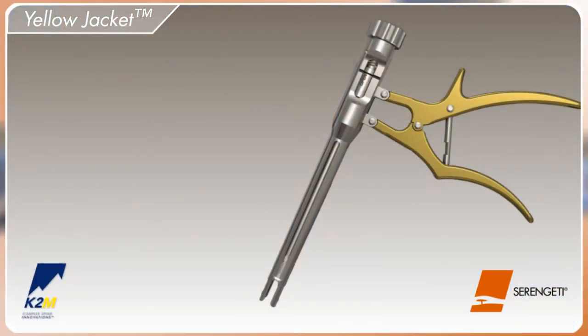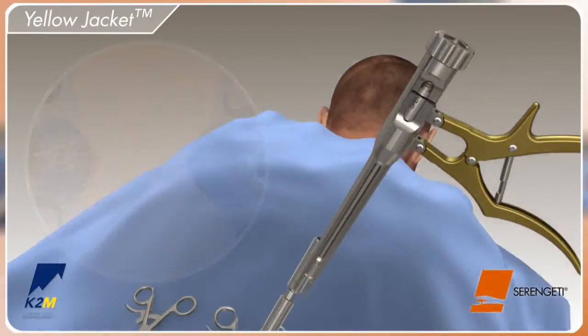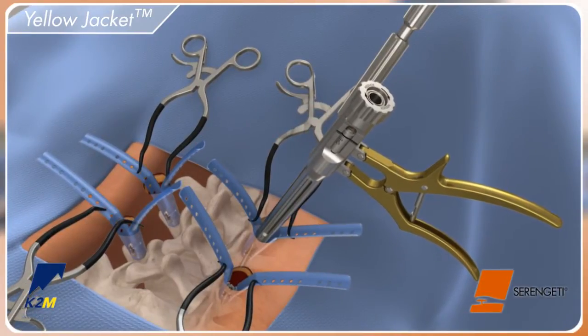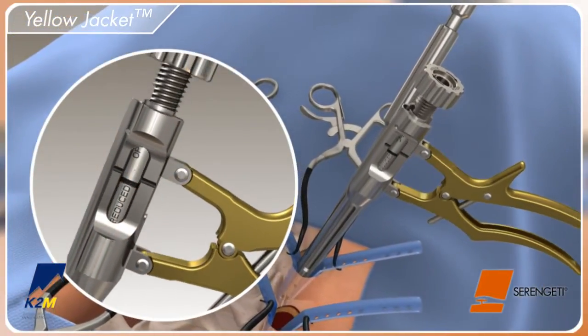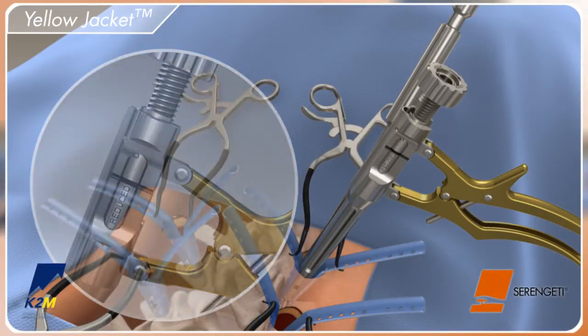If reduction is necessary, utilize the visualization provided by the retractors to determine the orientation of the screw head. Position the yellow jacket down the Serengeti retractor and apply a downward force directly over the screw head to attach the instrument. Pull axially on the instrument to confirm attachment. For fast action reduction, push the locking bar forward and squeeze the handles together. The line on the measurement window will confirm that the rod is fully reduced.